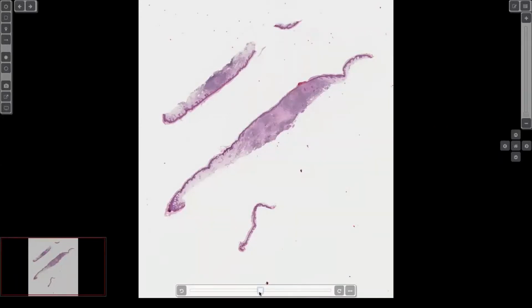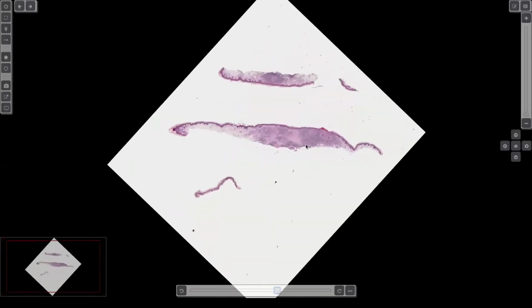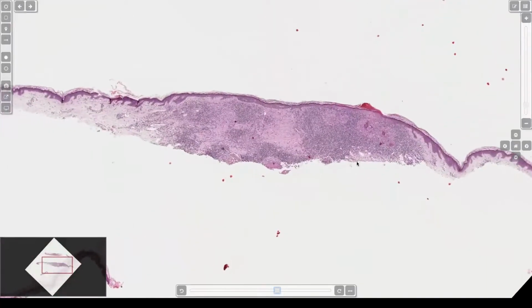And here's a nice shave. And again, you can see a dermal infiltrate. When you look at an infiltrate from low power, if it's really blue and diffuse, it's probably lymphocytes, right? If it's really pink or gray, it's probably histiocytes. It's not always true, but that's a useful thing because histiocytes have a lot of cytoplasm.